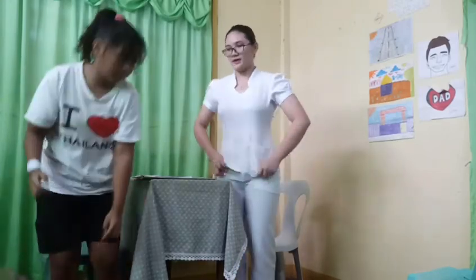acuity. So what I'm going to do here is position the client 20 feet away from the Snellen's chart, and I'm going to ask her to read the lines that are visible to her, and using this opaque card, I'm going to cover one eye to test. Okay. Now let's start. Miss Kaina, can you please transfer here?